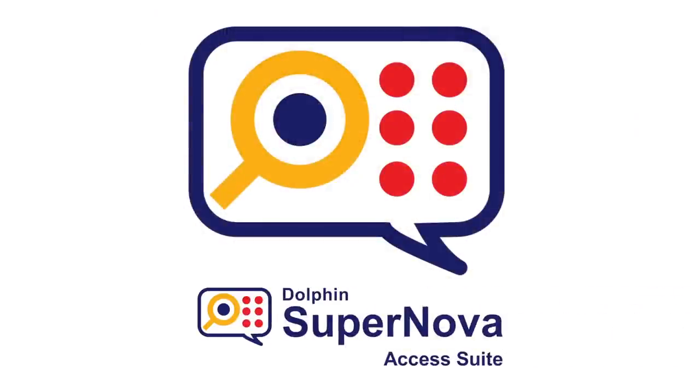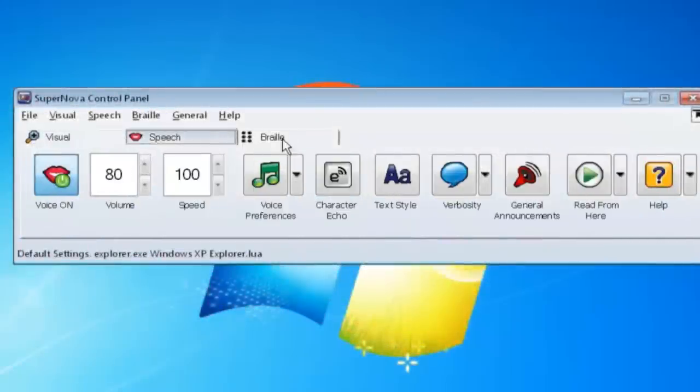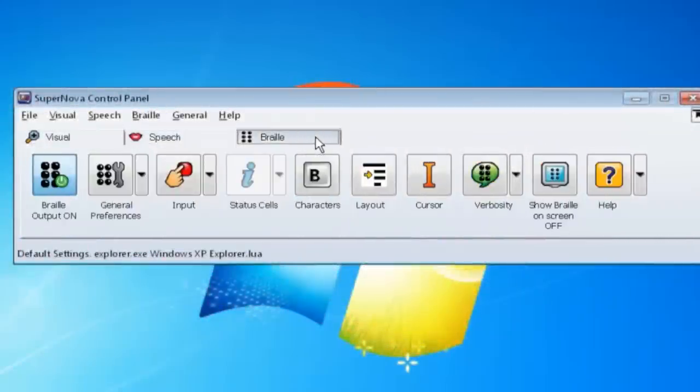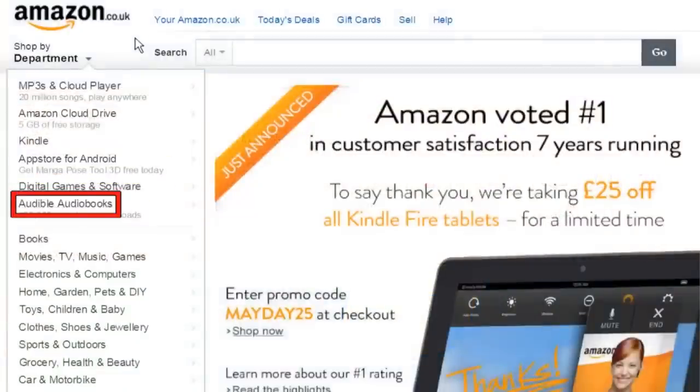Access suite. For any visual impairment. Use the magnifier, voice and Braille separately or together.